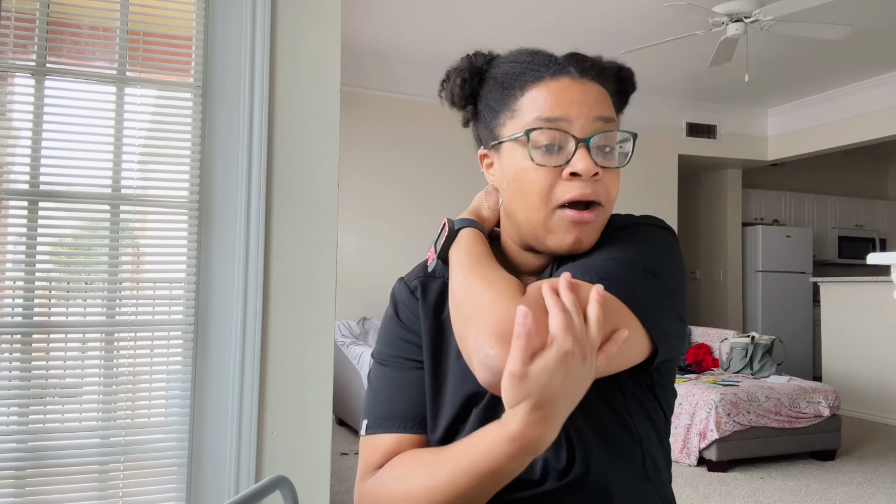Take your time. There's nothing wrong, even if you tell them, hey, I'm new here, or I just learned. That's up to you if you want to tell them your business, but take your time. They will appreciate you being on the slower side, rather than feeling all that torture pain because you were rushing and forgetting steps, and then you took the wrong tube, or you didn't do the order of draw. We don't want any of that. So definitely always remember to take your time.